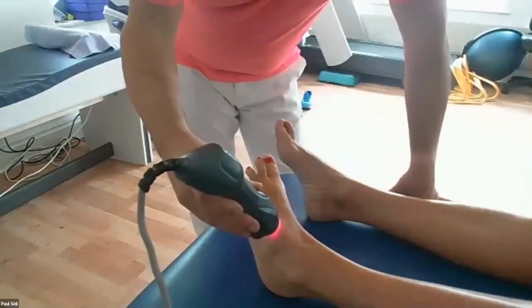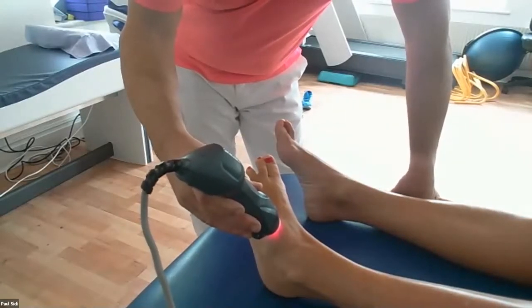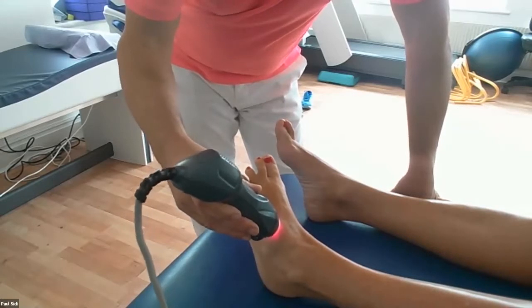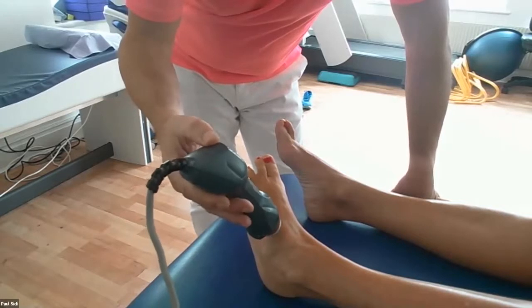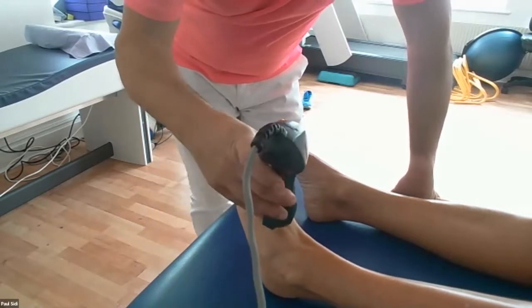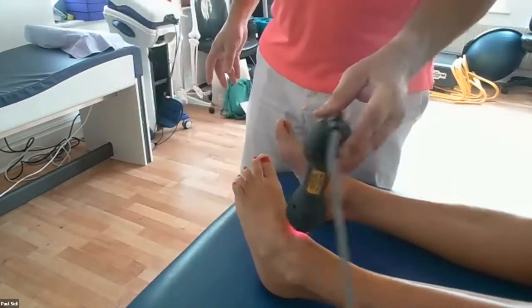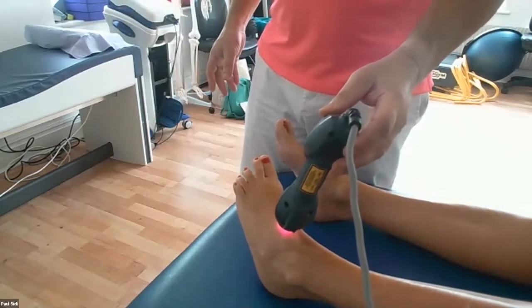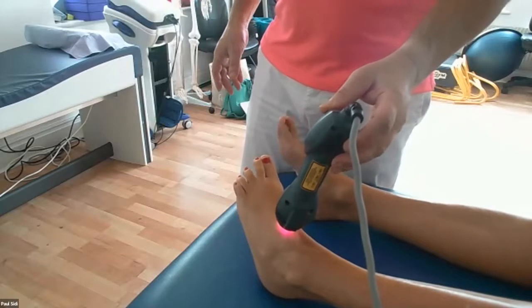There's 15 points. So 15 points for how many minutes was it? 6 minutes? It should stop in about 30 seconds. I don't have to do anything. I just leave it there. It stops, and I'm going to move into the next bit. I'll just go around all these areas and I will do the arthritis on here. As I said, I've got this on the high power.